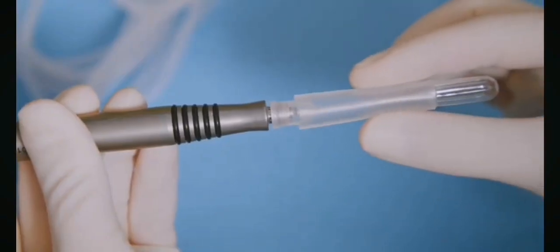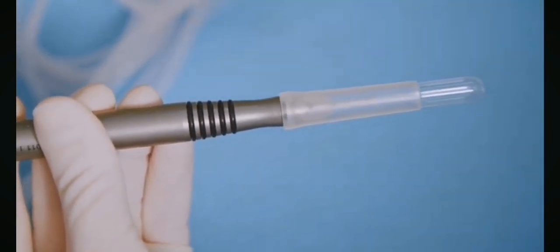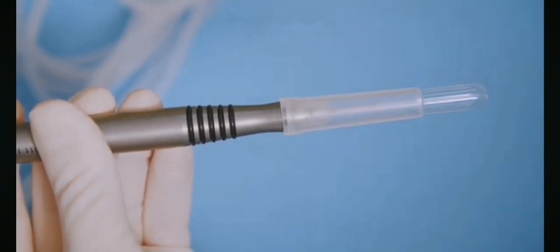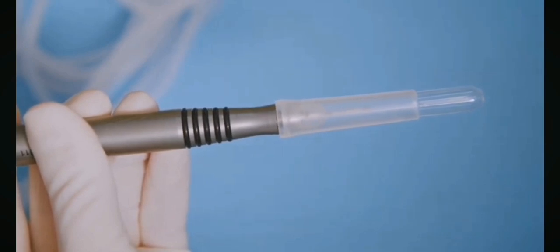Secure the test chamber over the irrigation sleeve. The irrigation sleeve must come up to the bevel of the tip. Pull the test chamber over the tip and sleeve until the back end is flush with the irrigation sleeve.